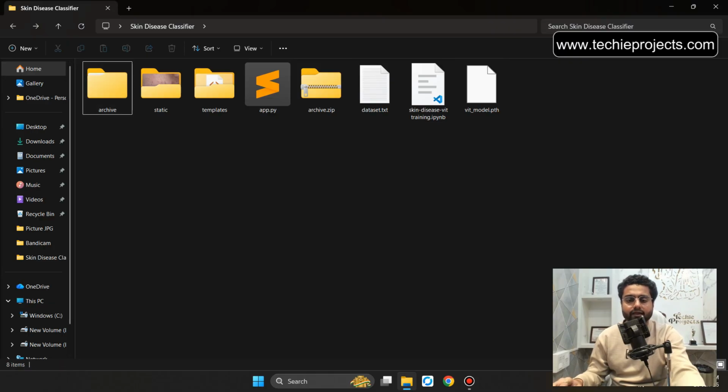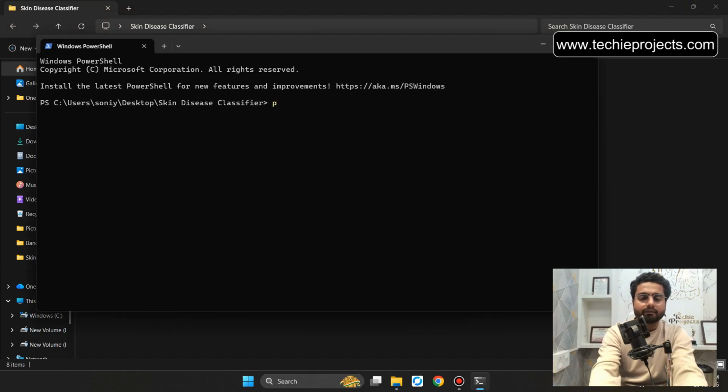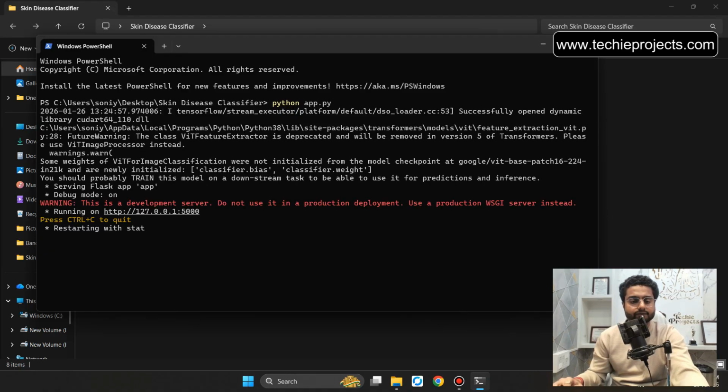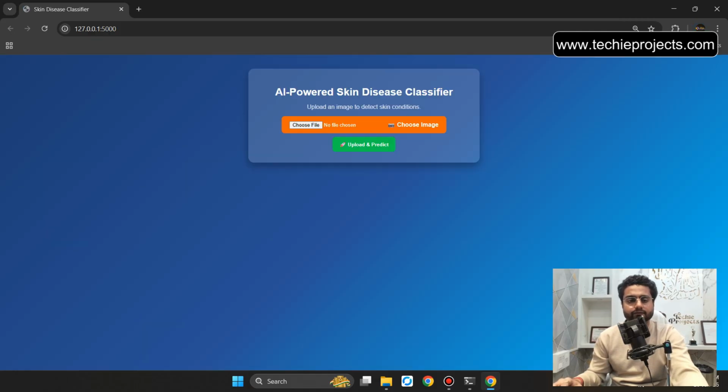Okay, so let's run the app.py file. We have to open terminal here. Then click on open in terminal and just write python space app.py. Then enter. Then it will generate one URL. You have to just click on that particular URL with the control. So just click on control and press that link. Then it will open in any browser.